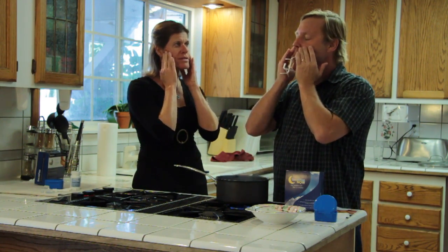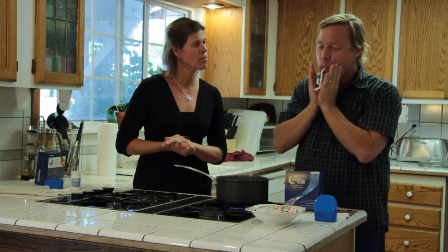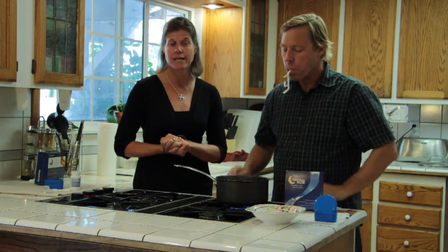There you go. It almost is like a Play-Doh effect. It's like molding to his upper jaw. And then, of course, he's going to make that sucking sound. Nice. Get all that extra air bubbles out. And this has been happening through that 30-second process. He wants to make this as comfortable as possible.